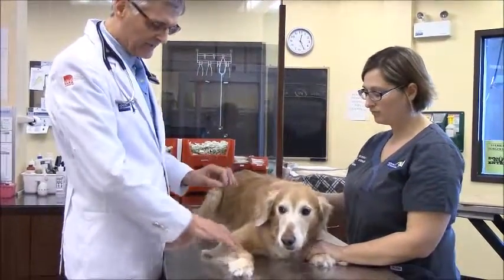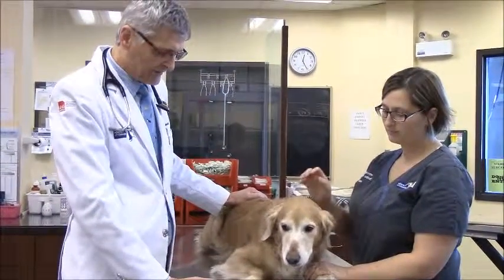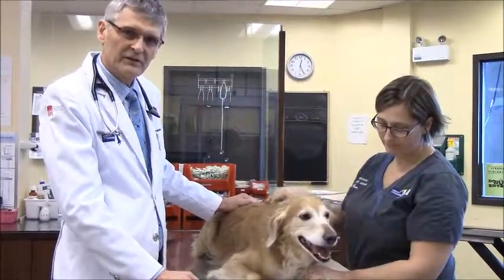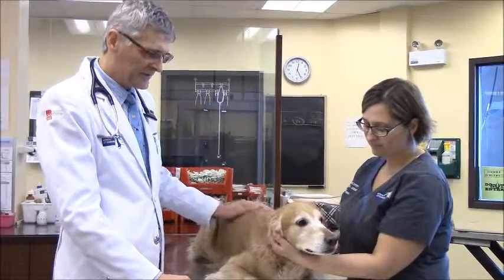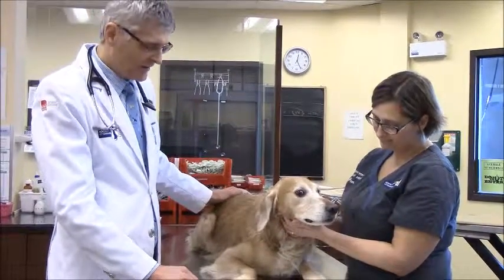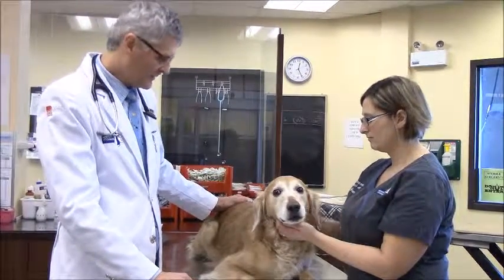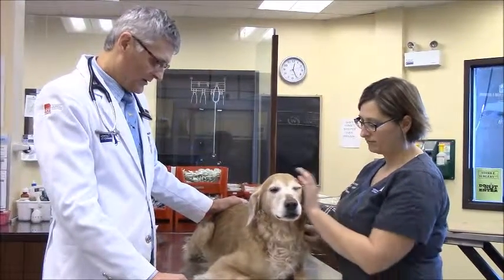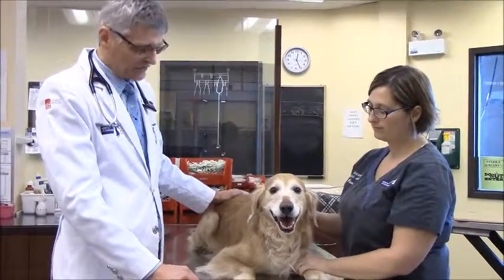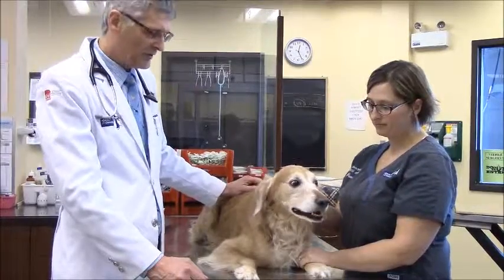After the sedative, she'll go back to the kennel for about half an hour. We're going to bring her back, put her on an IV, and induce anesthesia with an induction agent given intravenously. Then she's going to go to the dentistry room where her teeth will be scaled, cleaned, and polished. We might also take an x-ray of one or two teeth that we find questionable. During anesthesia, she's going to be on monitors tracking her blood oxygen, heart rate, and temperature.